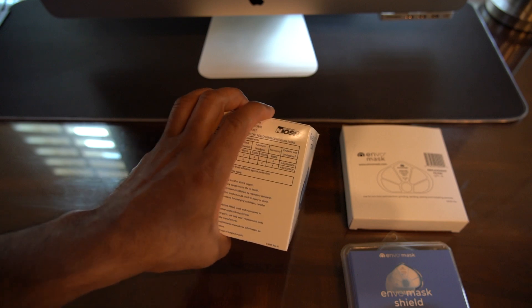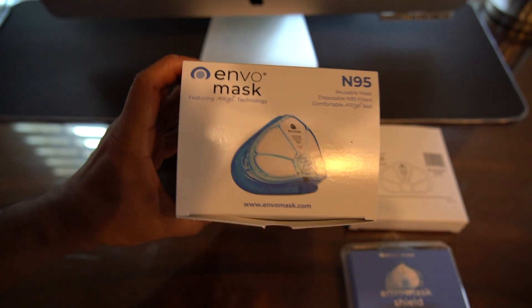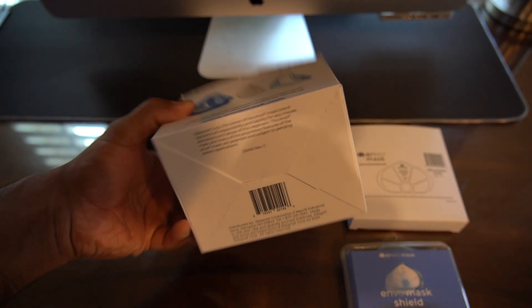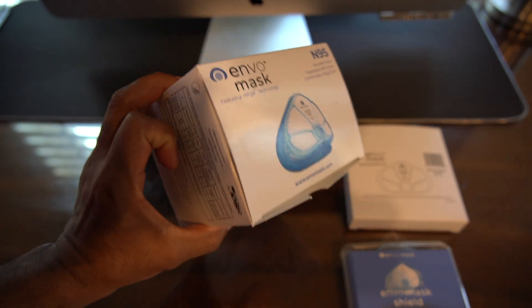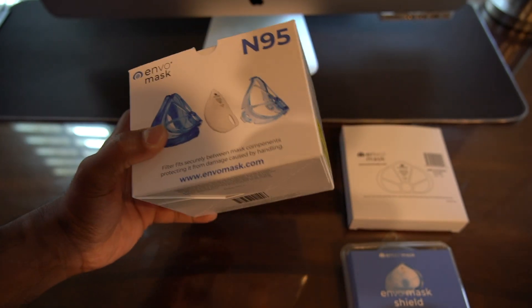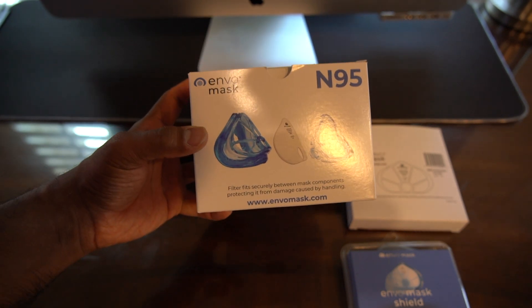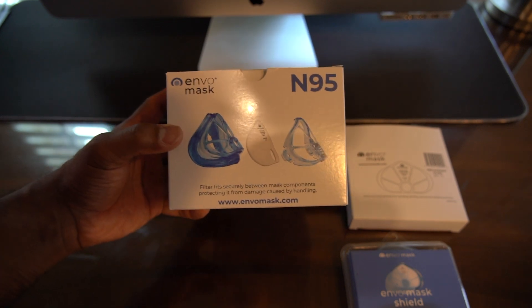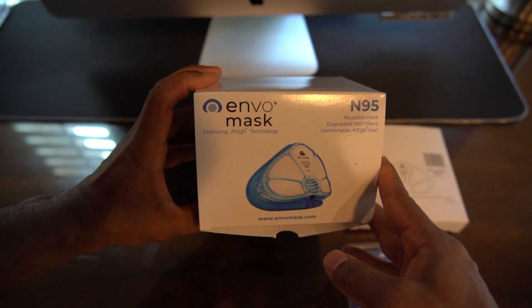I saw a couple of my buddies using this Envo mask, so I thought I'd check it out and make a video about the overall experience. Today is going to be an unboxing and quick review. I'm going to try it for a few weeks and then make another video showing the progress and experience with this mask.